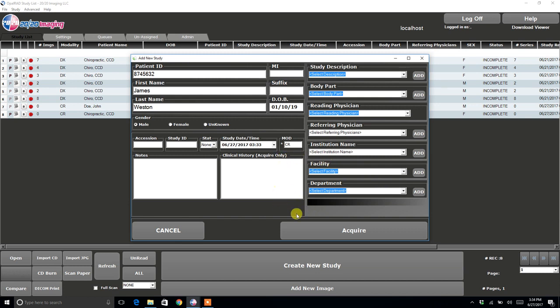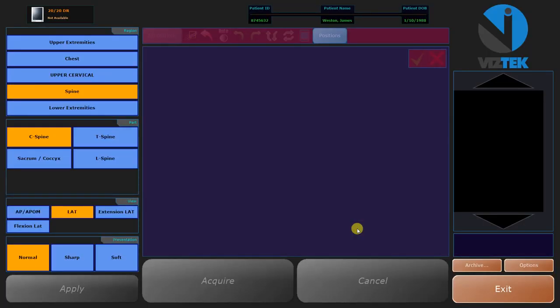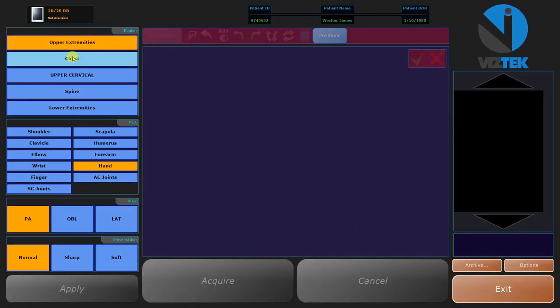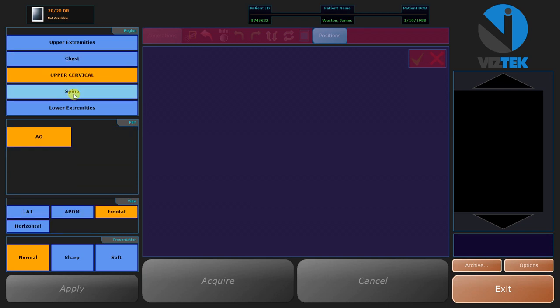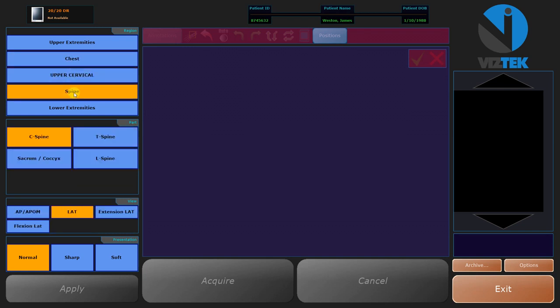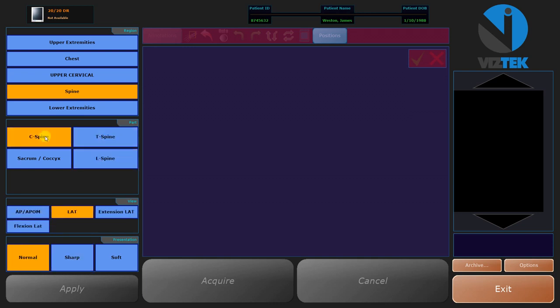So from here, you would select Acquire. And then over on the left side, this is the region that you are going to shoot. So we will just say Spine. Then you select the part. We will go C-Spine, Lateral.